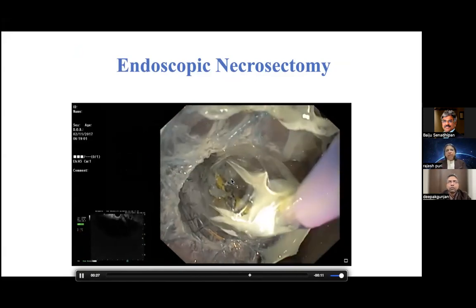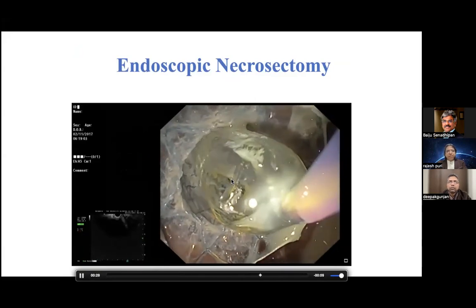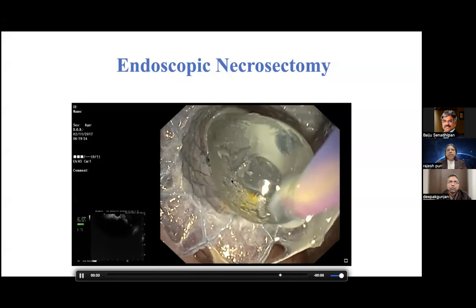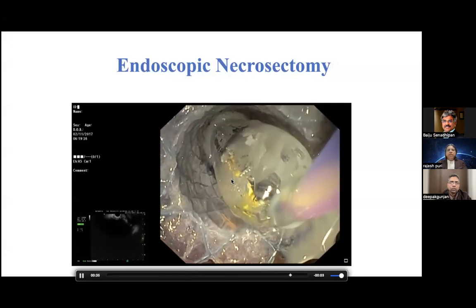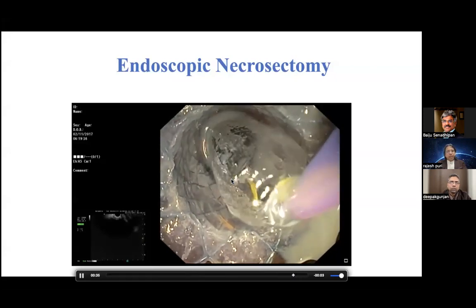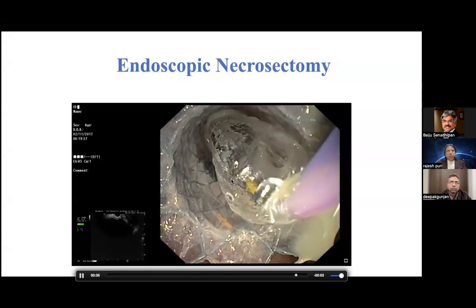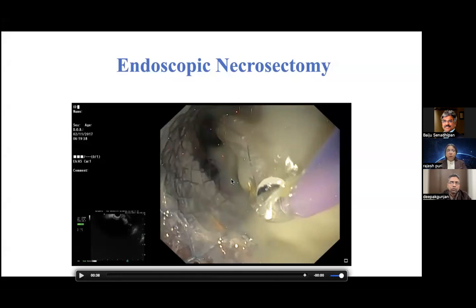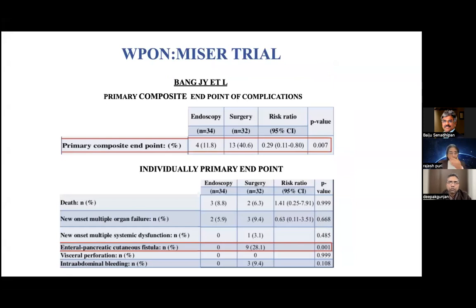In my practice, I don't dilate. This is a video where I'm dilating, but generally I don't dilate because these stents expand within 6 to 8 hours. You don't require to dilate. You just wait for it. But yes, if you are planning for direct necrosectomy, then you have to dilate, increase the size of the stoma, and then you take your upper GI scope in and do the necrosectomies.